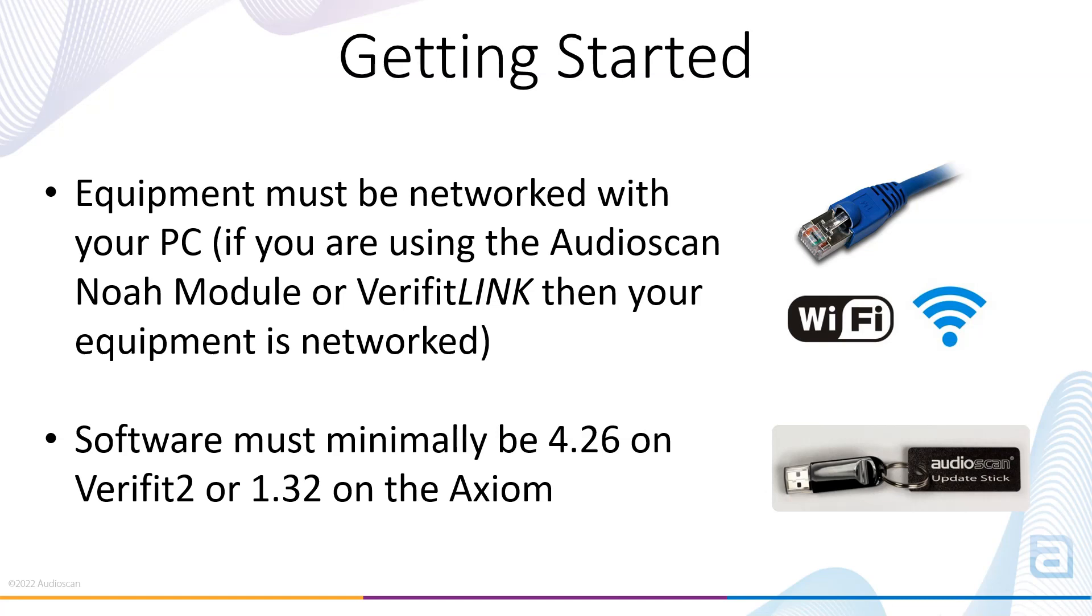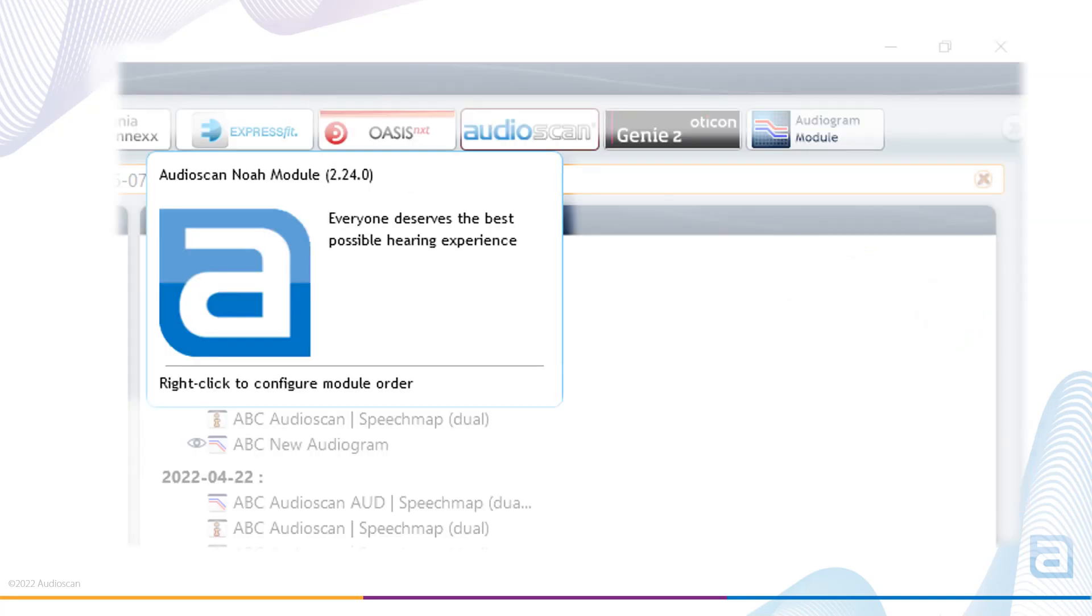To ensure the Audioscan Noah module can be updated from within the module itself in the future, you are going to need to update the Audioscan Noah module by downloading the latest version from our website and installing the 2.24 software update. Once you have updated the Audioscan Noah module to 2.24, the first step is opening the Audioscan Noah module from within Noah 4.